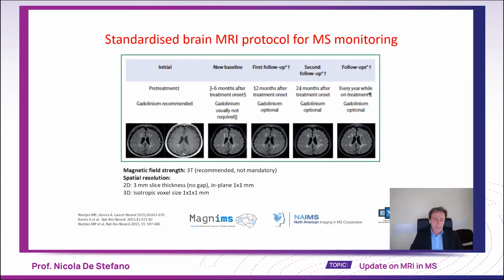When I say standardize, I mean at least within patients: using very similar protocols, very similar timelines, and sequences that are always constant over time.